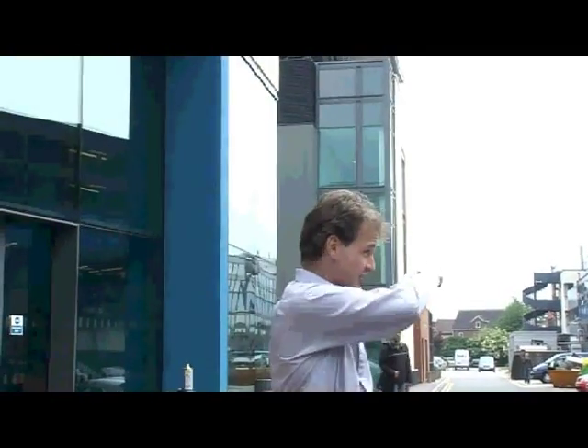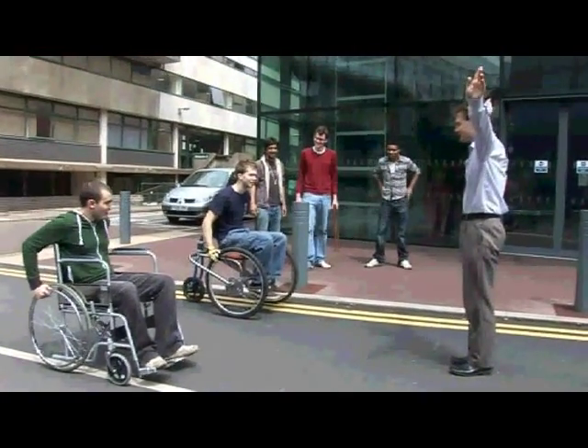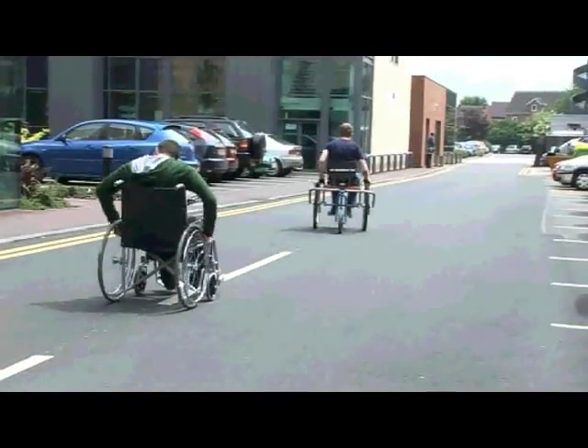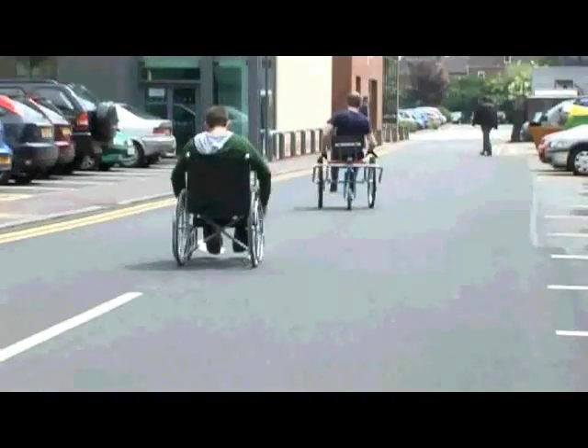We're going to go up to the end here, turn right, then first right again — so we do a circuit and come back, and the finish line will be here. Is that okay? You up for that? On your marks, get set, go! And they're off. The appropriate technology wheelchair is doing okay. He's taking a bit of a roundabout route, but oh my goodness. Come on, go on!